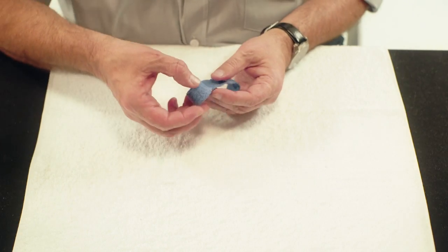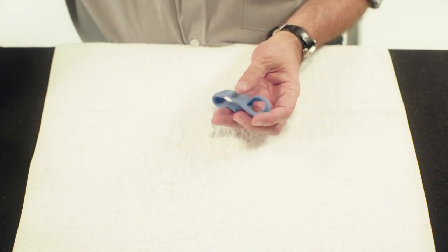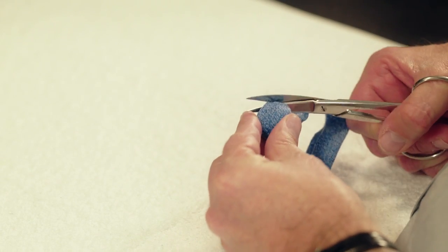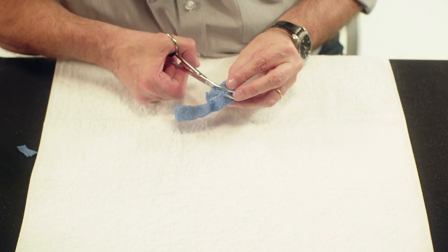Let the material harden and remove the orthosis. Round the edge on the side of the index and little finger.